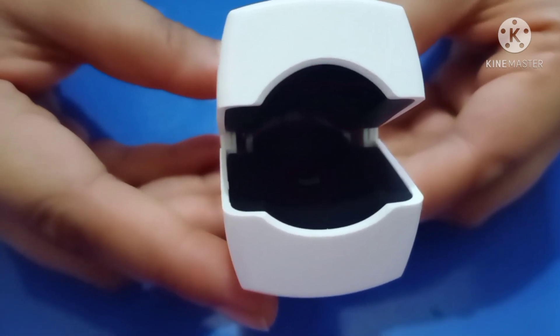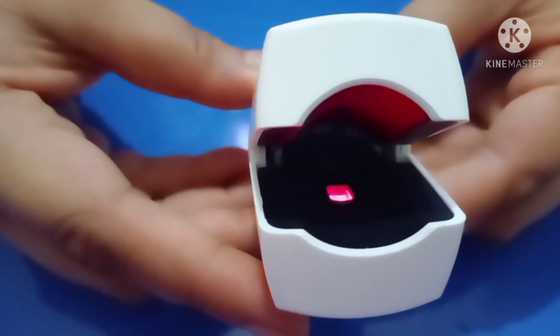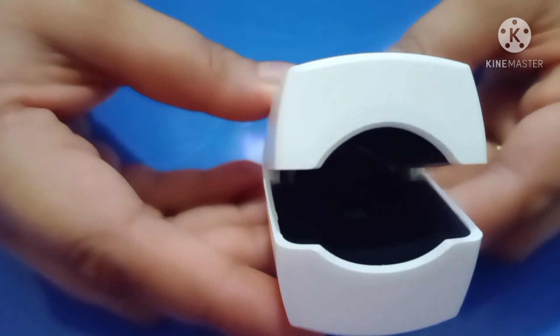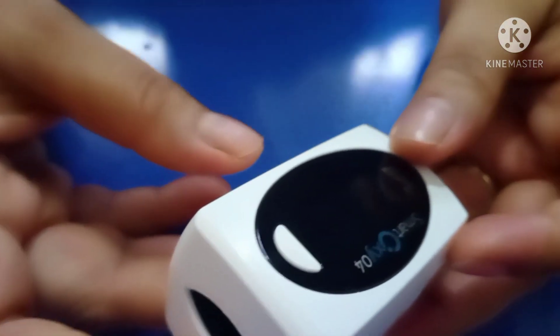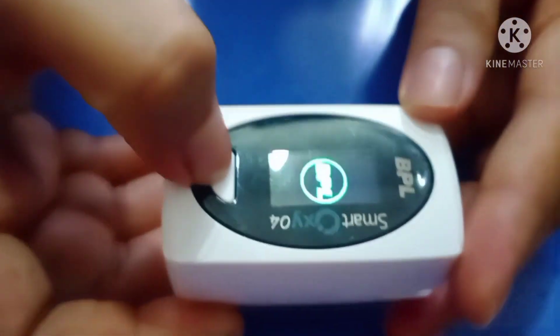There is red and infrared light to measure SpO2 level. A small beam of light passes through the blood in the finger and measures the amount of oxygen.